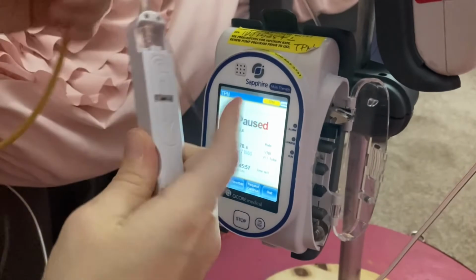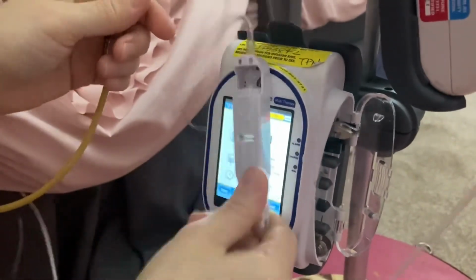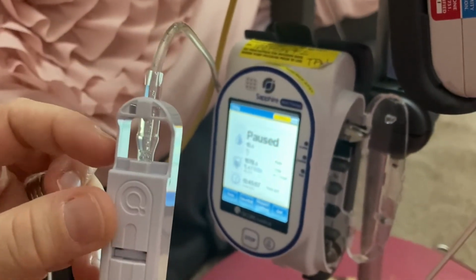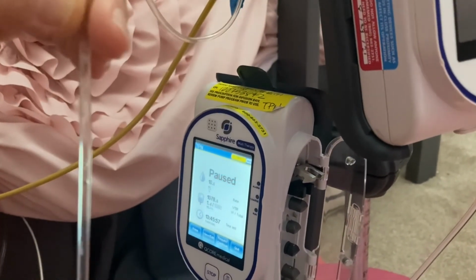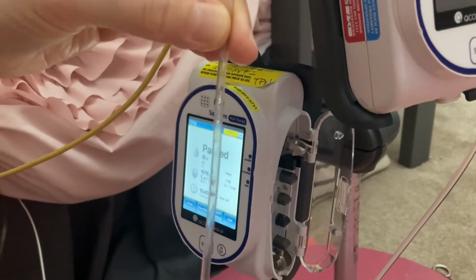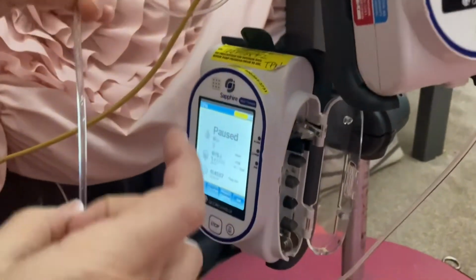So we just hit it on the pump, her bed, whatever, just trying to get the bubbles to pop up in the tubing. And then when you see the bubbles pop up in the tubing, you just want to flick them until they go all the way back up into the bag.